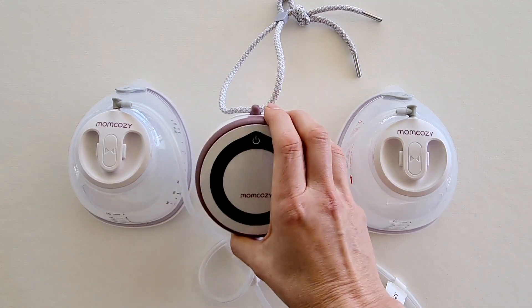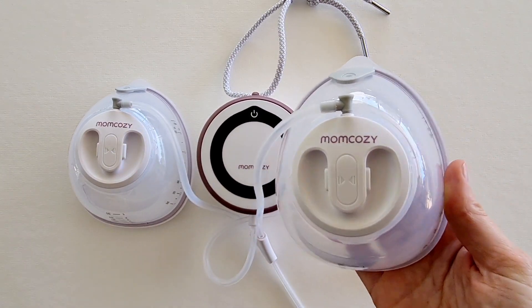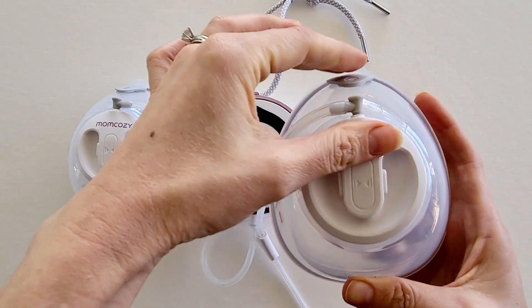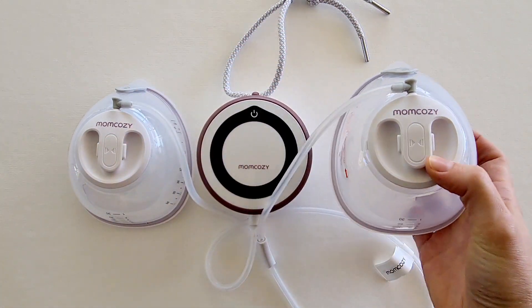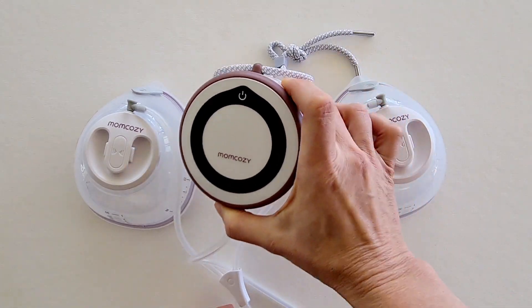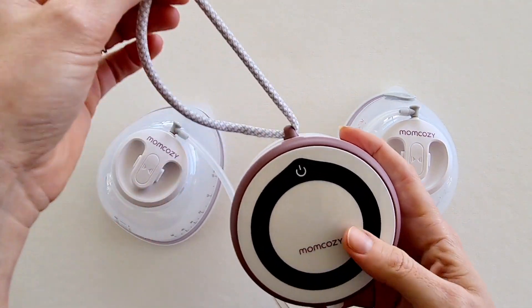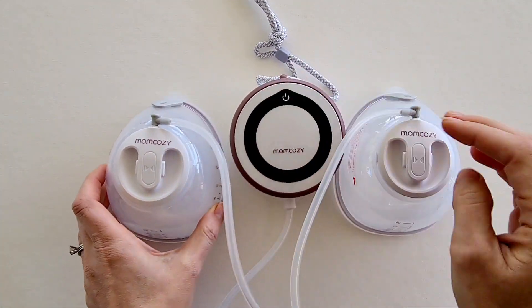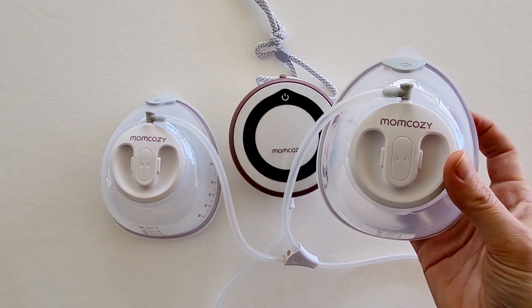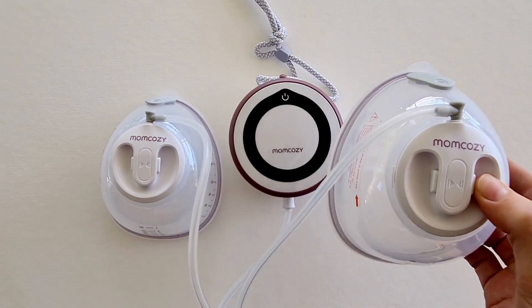A couple of the downsides: this is a portable and wearable breast pump, however it's not an all-in-one. Some other pumps in the Mum Cozy range — like the M5 — are all-in-one where the motor is attached to the collection cup. With the V1, you have a separate motor and tubing that attaches to the collection cups, so whilst the cups go in your bra, you'll need to have the pump around your neck or waist. Not having the motor in the cup does mean it's slightly smaller and more discreet.